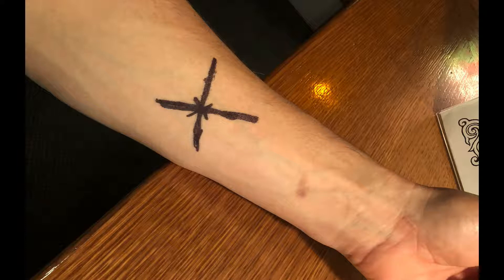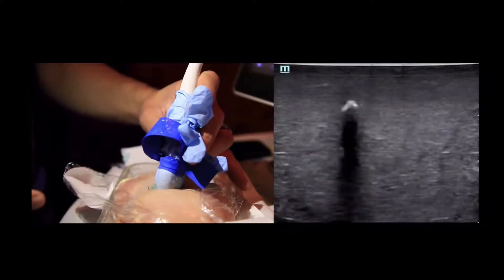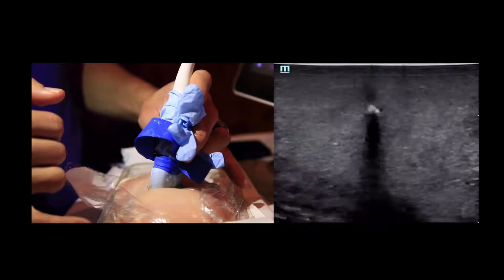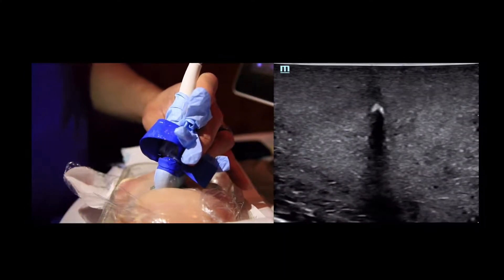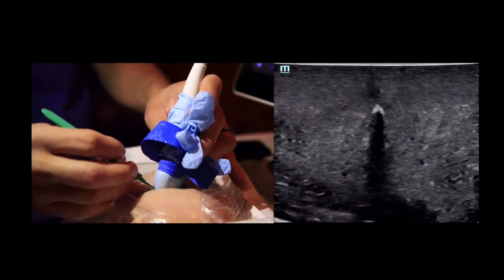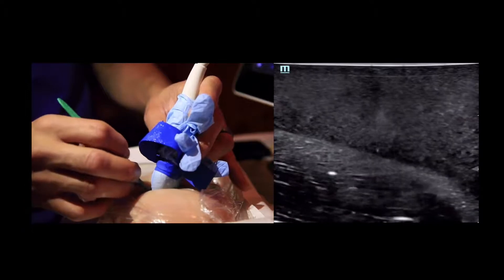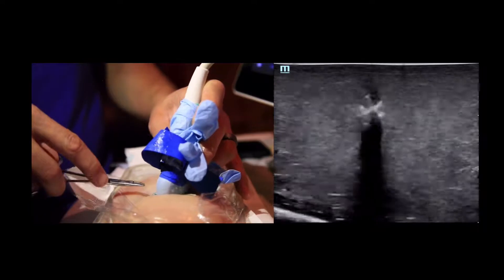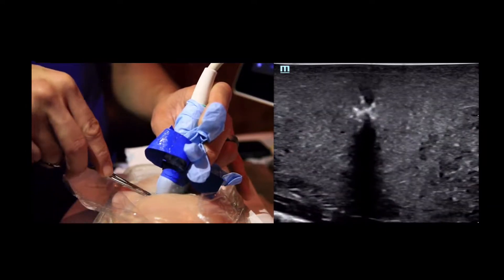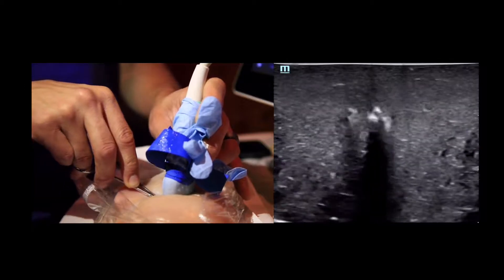So what I do is I identify the structure, usually a splinter in my case. I find it in the short axis, not the long axis. Once I know that I'm centered just distal to where the foreign body ends, I'm going to do a little kind of X incision underneath the skin. After that I'm going to go in there with the hemostats or the little pliers, and you can see right here that you're actually able to see where your two ends of your hemostats or your pliers are in relation to that foreign body.